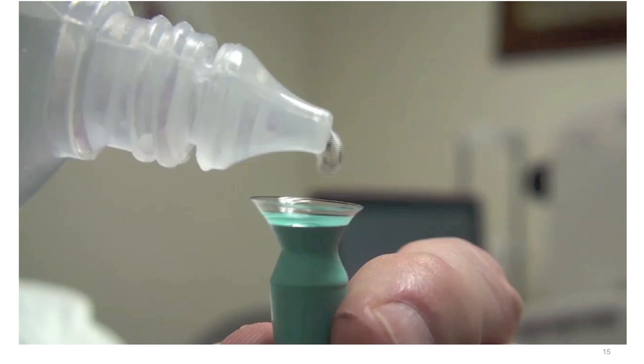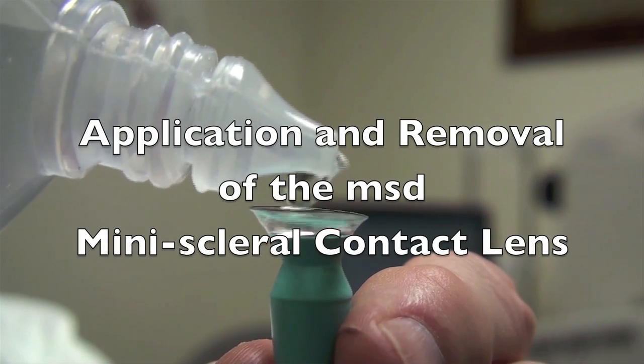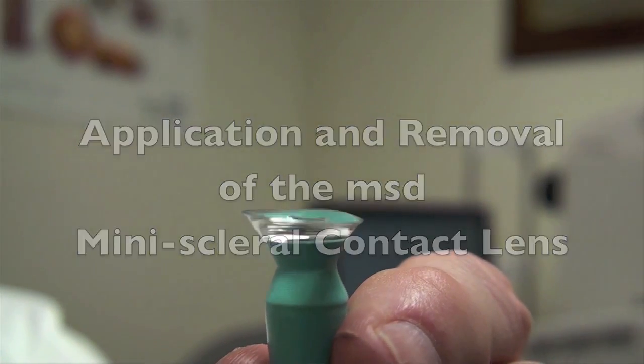There are a number of ways that you as the clinician can apply the lens to the eye. My preferred way is to hold the lens with one of these green suction cups, fill the lens fully with non-preserved sterile saline, and apply it to the patient's eye. With this device, I'm able to hold the lens slightly, so if the patient blinks or closes their eye, I'm not going to have the lens wind up on the floor. I'm able to control where that lens is going.